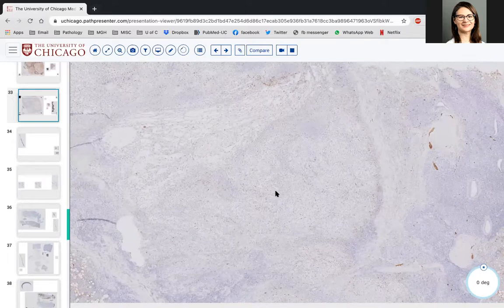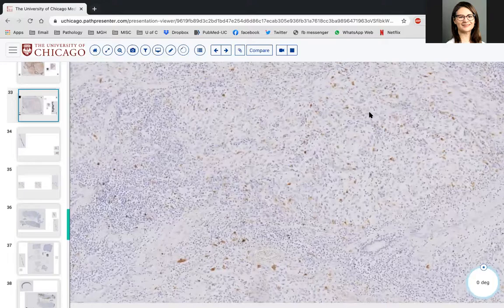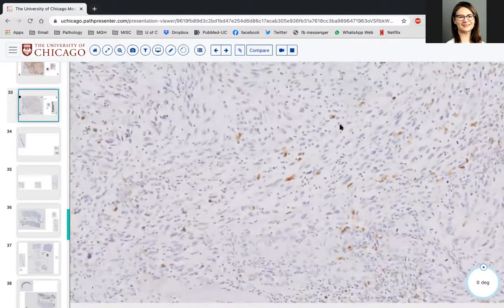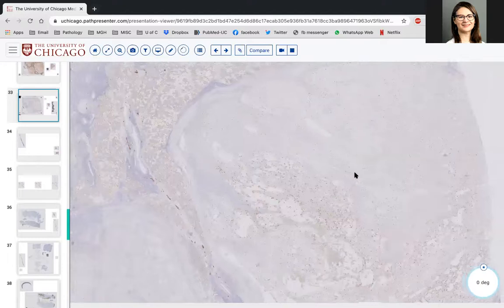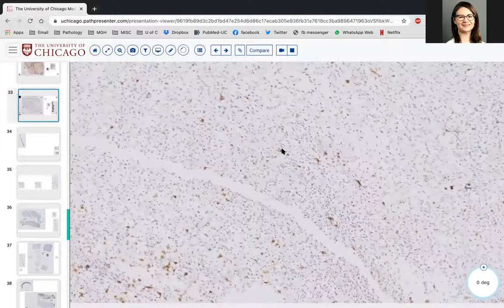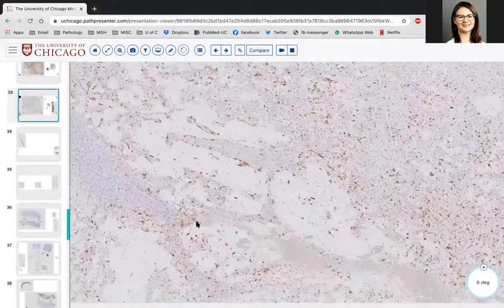More often than not, you have more than one from the second bag, but because myoepithelial cells' immunoprofile kind of varies depending on their morphology and what they choose to express, you don't always have to have strong S100. For example, plasmacytoid or hyaline myoepithelial cells tend to be much more strongly S100 positive than the spindled myoepithelial cells.